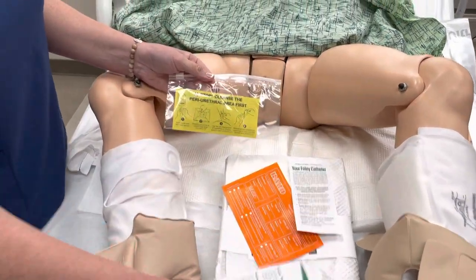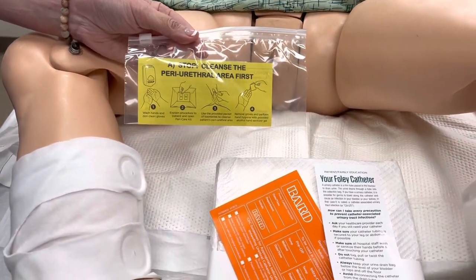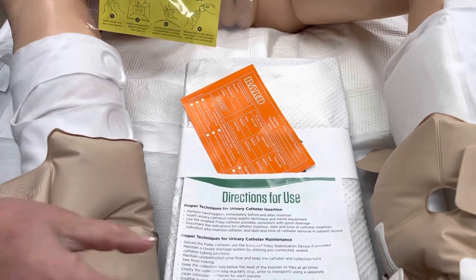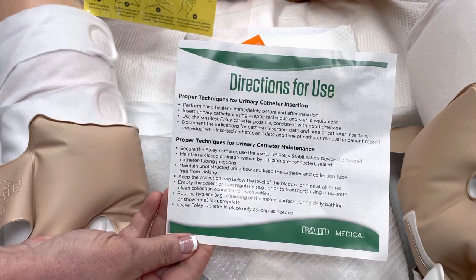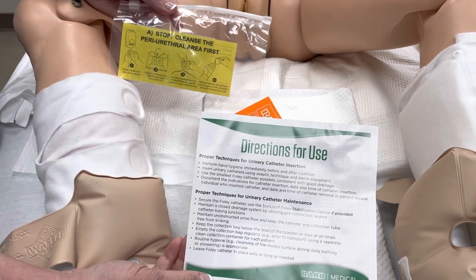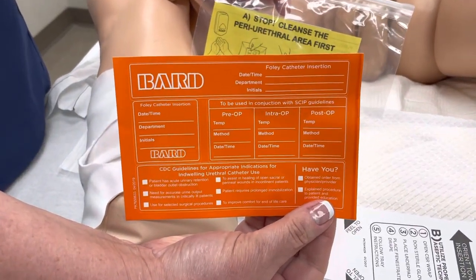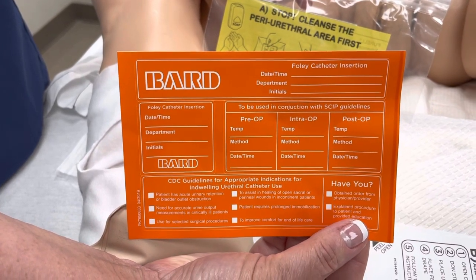When you open up your kit, there are going to be several different pieces of literature in there. First, you'll have patient education materials that you can provide to your patient and their family explaining what we're going to be doing, why we're putting this in, and how we're going to maintain it — make sure to give that to them. We're also going to have directions for use with every step-by-step piece of the process including pictures, which is a great reference if you haven't put one in a while. Additionally, this orange sheet is going to have your label so you can make sure to label your catheter with the date, time, and your initials so that we can track when it was inserted.